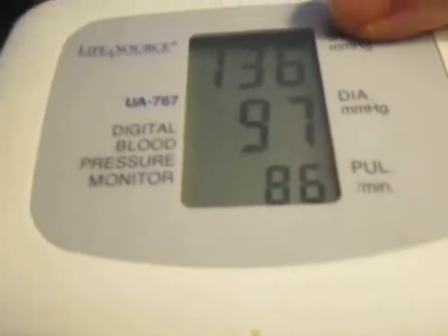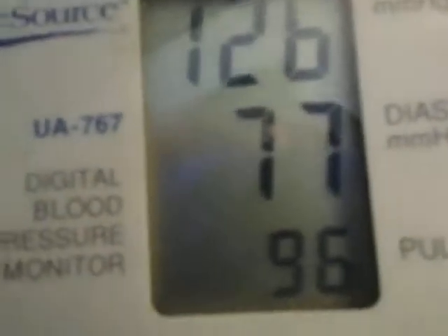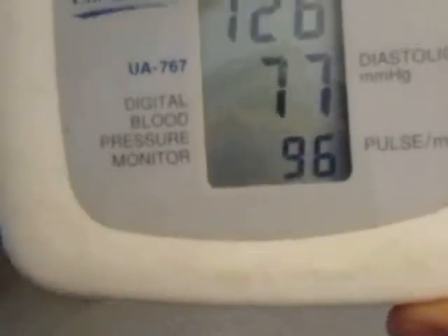Okay, now on my right arm — that was high last time — I switched them, and it's still high. It's 136 over 97, 86 beats per minute. Whereas this one is now 126 over 77, 96 beats per minute.